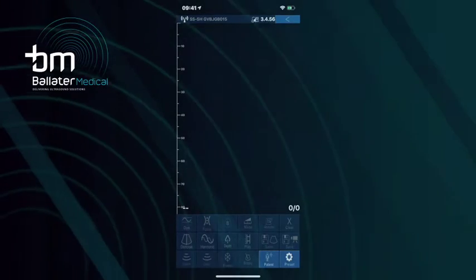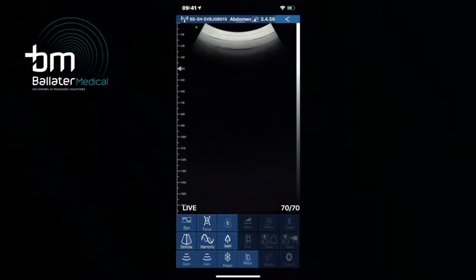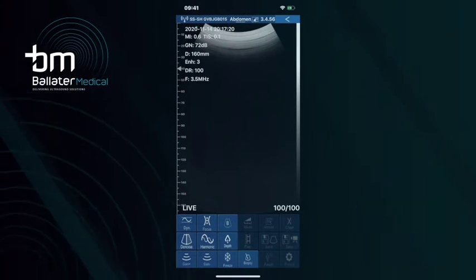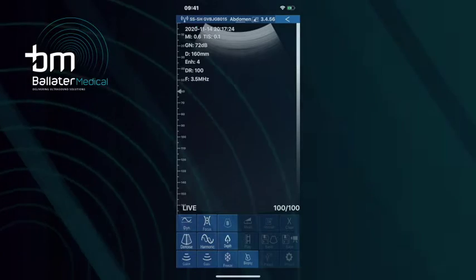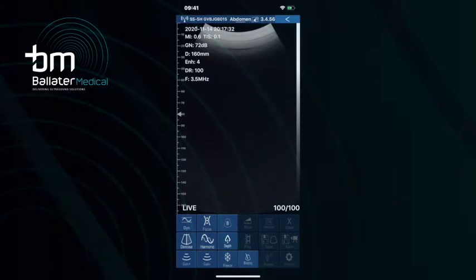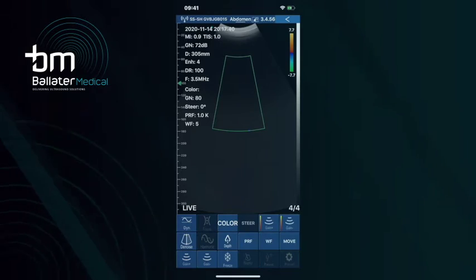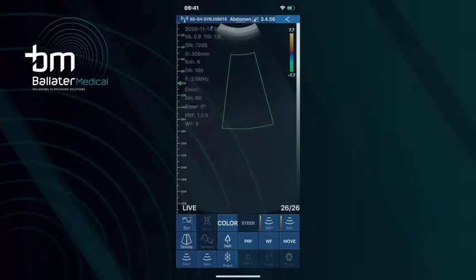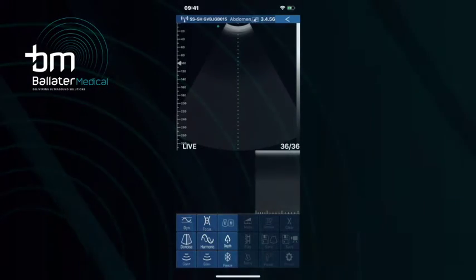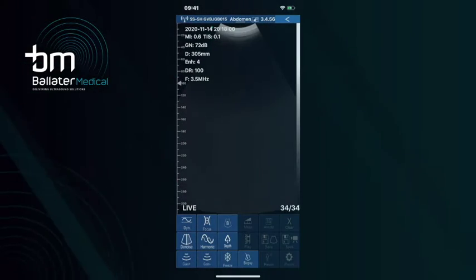Open your application. The default setting is the freeze screen, so you unfreeze the screen and you'll see you are now ready to scan. So familiarize yourself with the various functionality that's packed into this piece of software. We're able to adjust dynamic range, denoise functions, focus, frequency range settings, gain settings, as well as an array of other functions, including color Doppler, M mode, pulse wave, etc. So familiarize yourself with the device before you plan your class. You'll see there really is quite a lot to pack into that little software application. So you're now ready to scan.